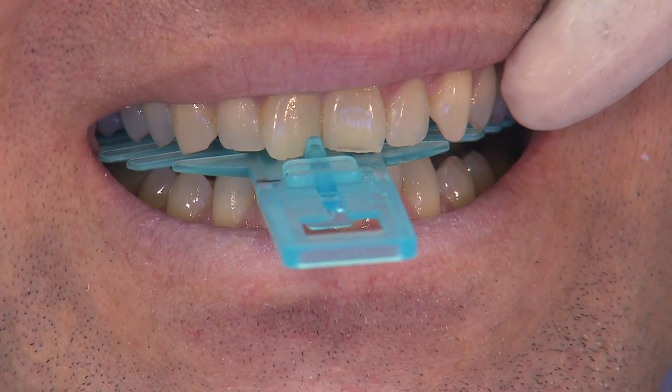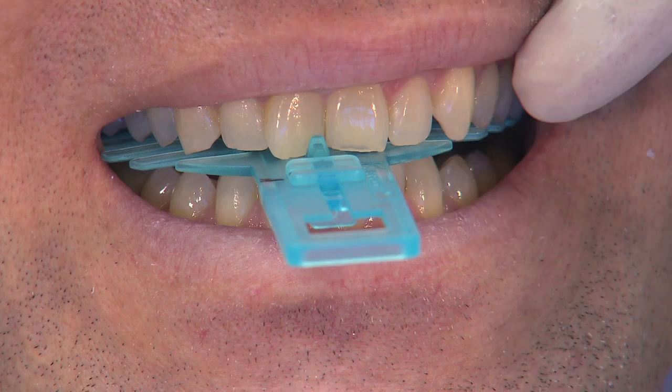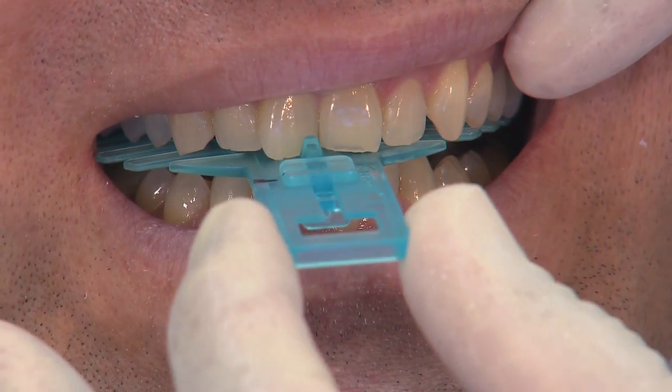And teeth number 8 and 9 are in a little groove on the top, and 24 and 25 are in a groove on the bottom. So I take the Sharpie and I just put a mark right there, which represents the patient's normal bite.